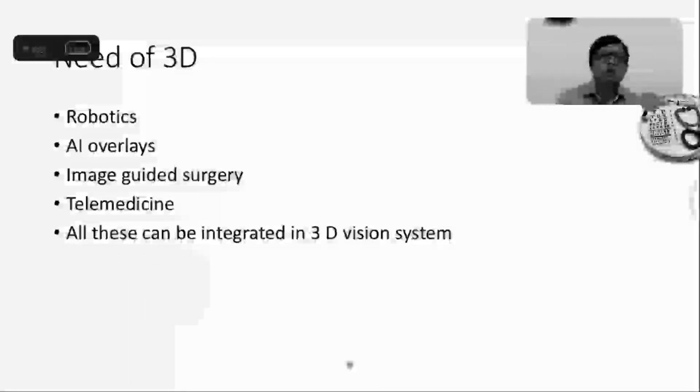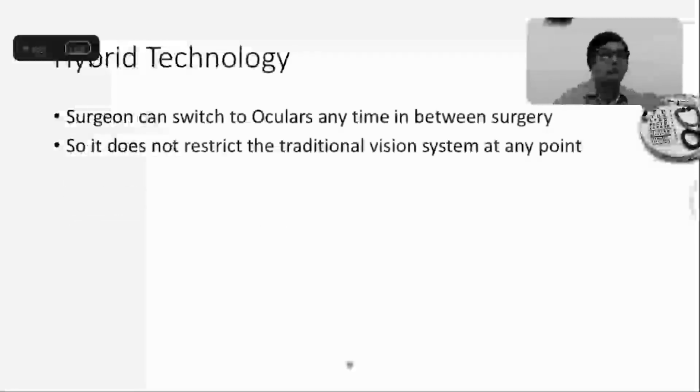The need for 3D is nowadays more important because there are robotic surgeries in other subspecialties, specifically urology and other surgery. Robotics, artificial intelligence overlays, and image guided surgery are there in our ophthalmology. We do image guided surgery with the OCT. Still not available here, but abroad we are seeing OCT guided surgeries, particularly in macular hole surgeries. Telemedicine, all these things can be integrated in this three-dimensional vision system.